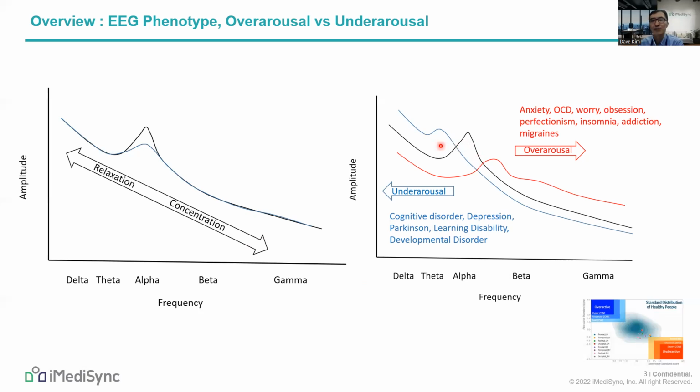Frontal alpha dominates compared to the posterior alpha. Alpha rhythmicity disappears. Finally, theta rhythm appears, shown in the peak frequency located in the theta band instead of the alpha band.